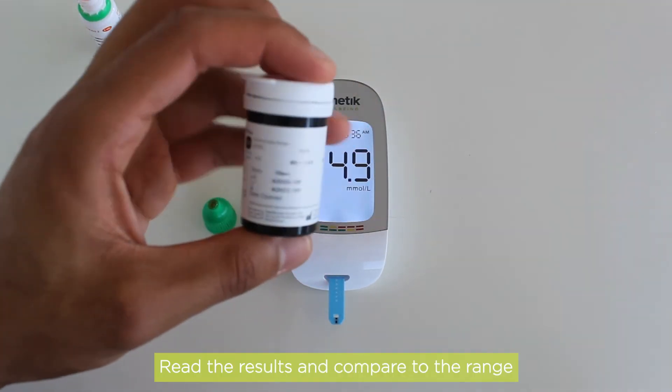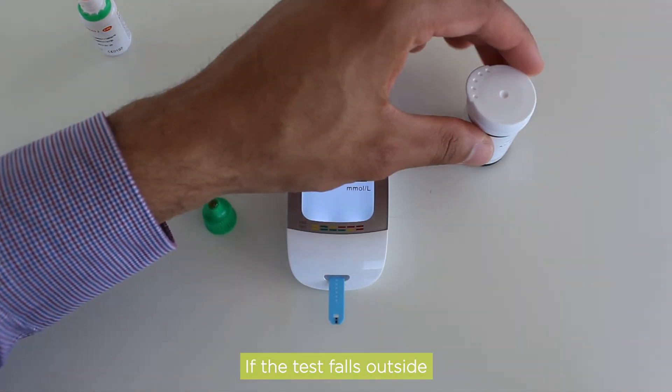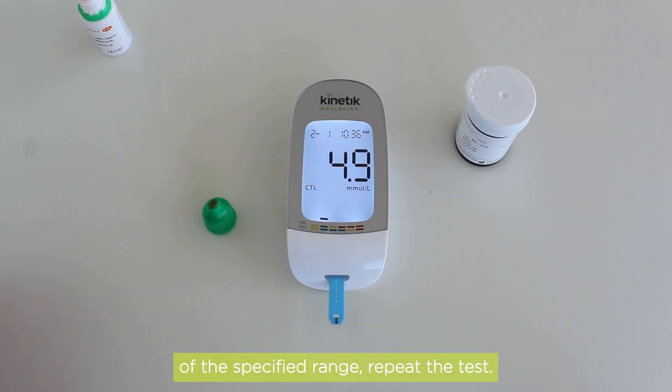The meter will count down from 5. Step 3: Read the results and compare to the range printed on the control solution vial. If the test falls outside of the specified range, repeat the test. If it falls outside the range again, please contact Kinetic Wellbeing.